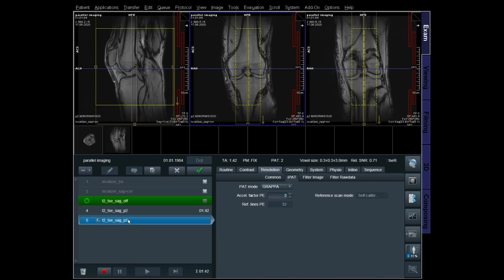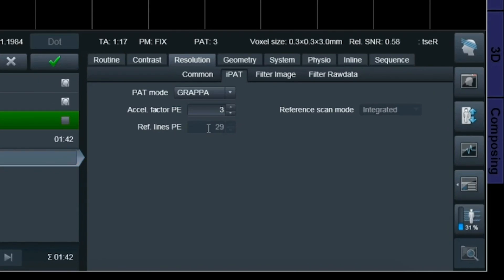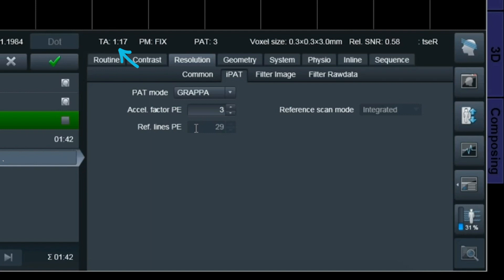Now let's go for PAT3. The SNR went from 0.71 down to 0.58, so I'm losing even more signal. But I also saved more scan time, because now I'm jumping every third line in K-space in the phase encoding direction.